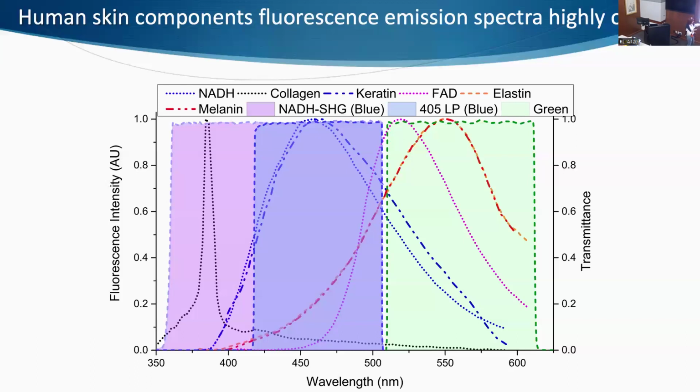It's not fluorescence, but it separates much easier compared to the other fluorescent signals. We usually work with two spectral windows. You can separate a group of these molecular components, but definitely not all of them. So that's generally one limitation of fluorescence microscopy.